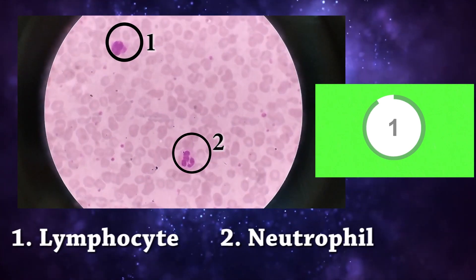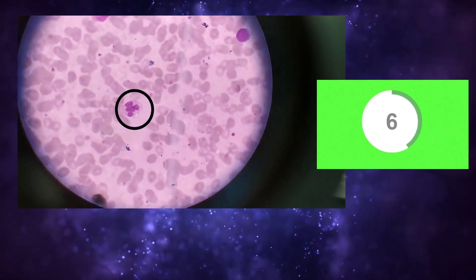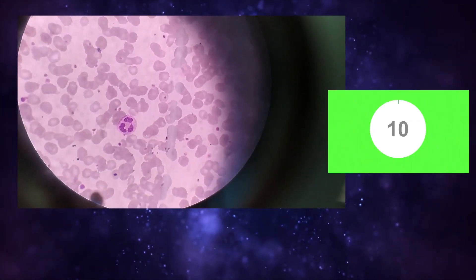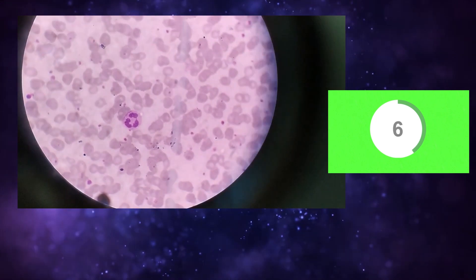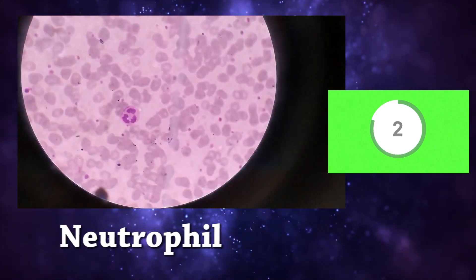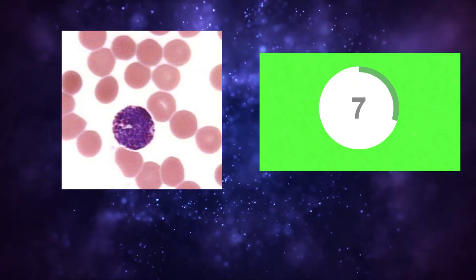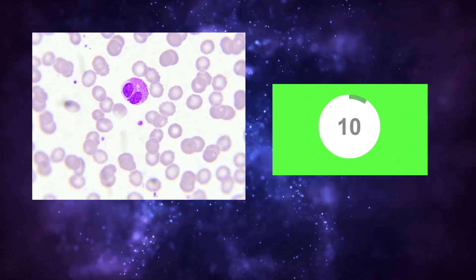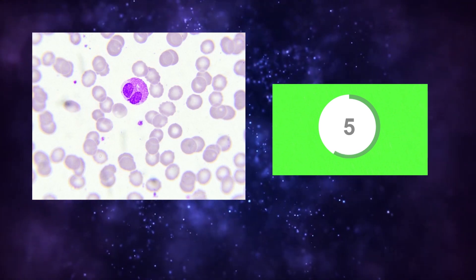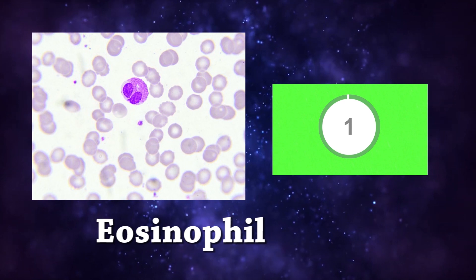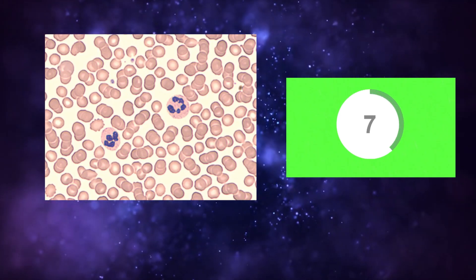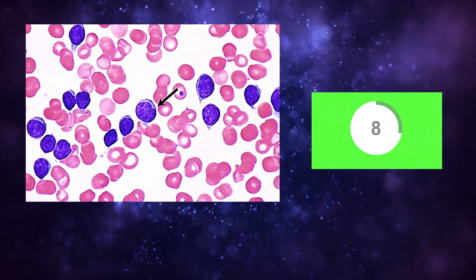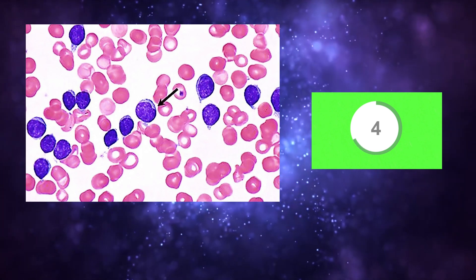Lymphocyte and neutrophil. Neutrophil. Neutrophil. Eosinophil. Eosinophil. Eosinophil and neutrophil. Eosinophil, eosinophil, lymphocyte.